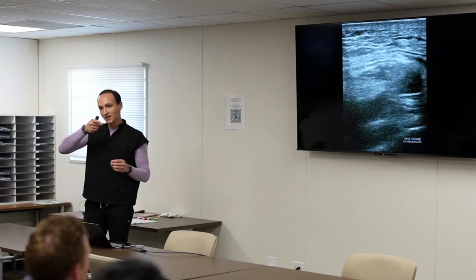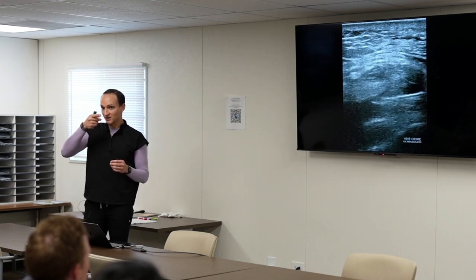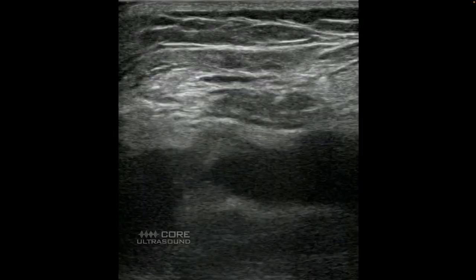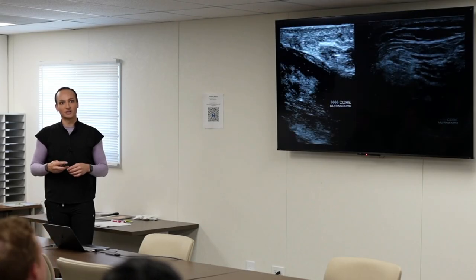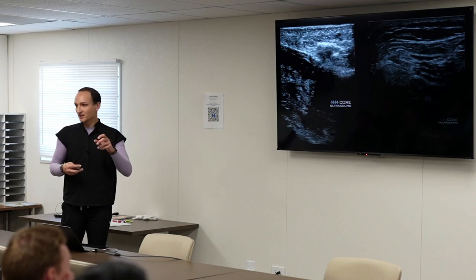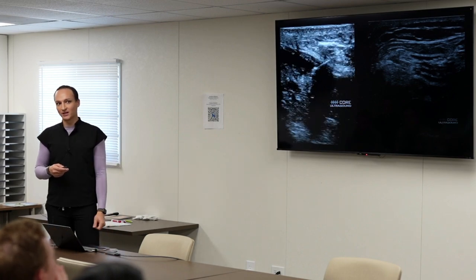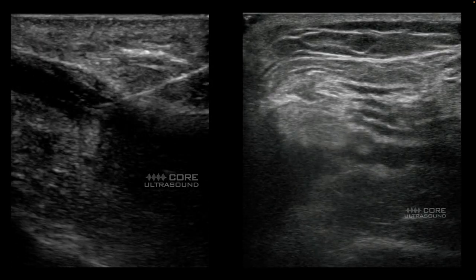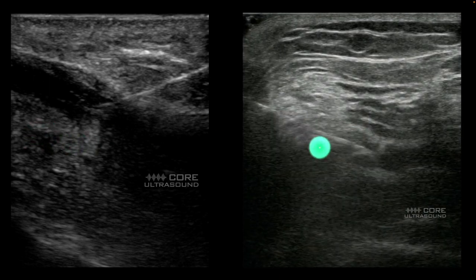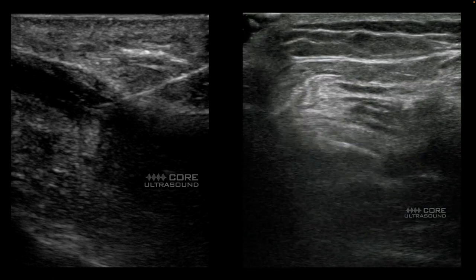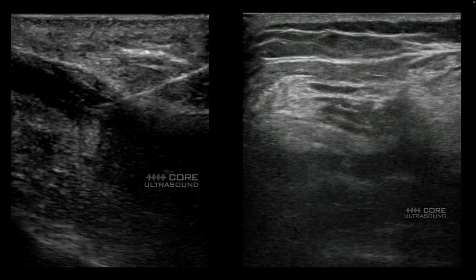For injections: after aspirating I'll put a little lidocaine in — it's the same technique. You can see the bubbles appearing in the joint as I inject — those are from injecting lidocaine. The technique is quite similar for aspiration versus injection; the only difference is whether you're aspirating or pushing fluid in. This applies to all joints.